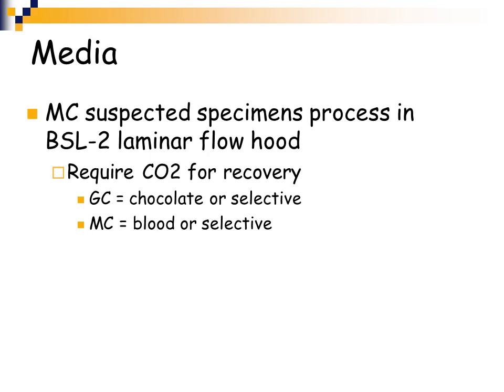The Neisseria gonorrhea and Neisseria meningitidis require CO2. So you're going to incubate the specimens in a carbon dioxide incubator as opposed to an ambient air incubator or an anaerobic incubator or jar.